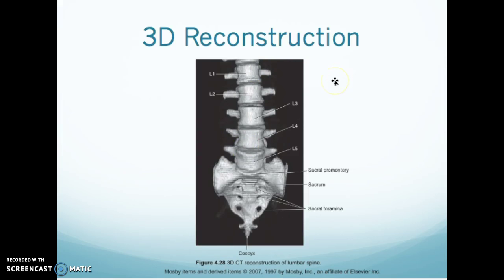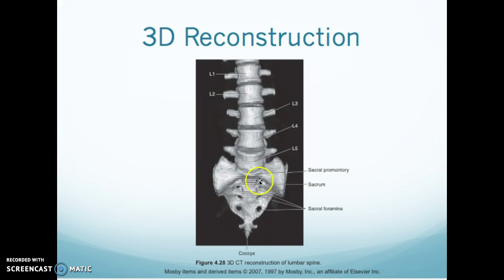This is a CT 3D reconstruction. L1, 2, 3, 4, and 5 — I usually count 5, 4, 3, 2, 1 from the bottom. If I can't tell if there's a transitional vertebral body, I will look for ribs as my stationary landmark. You can see the sacrum here and the sacral foramina, which are the openings where nerves come out.